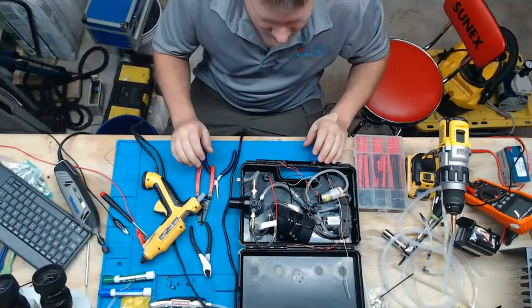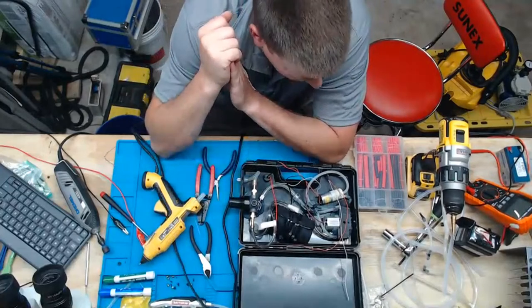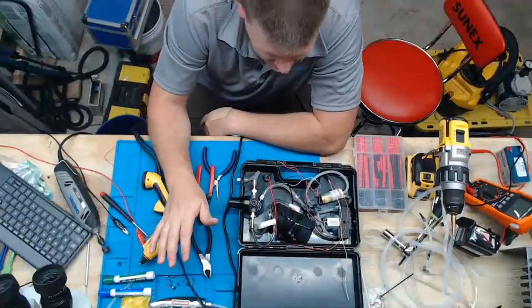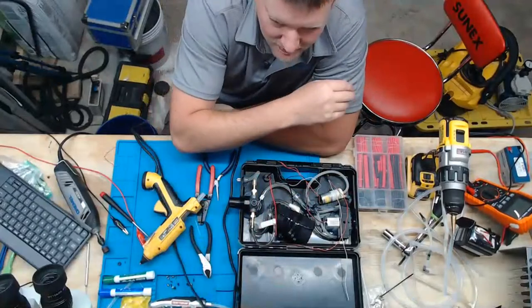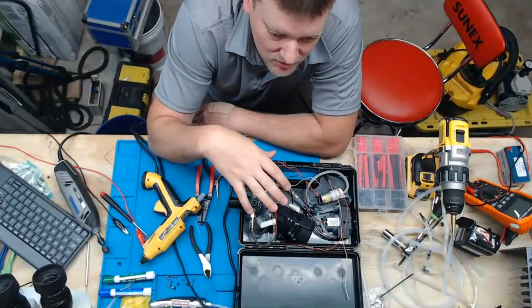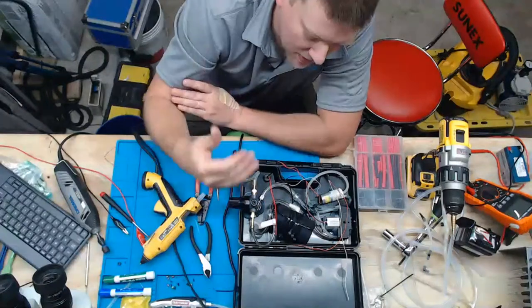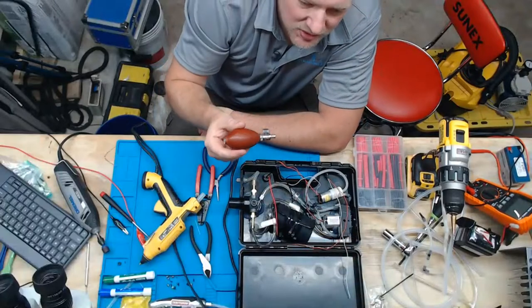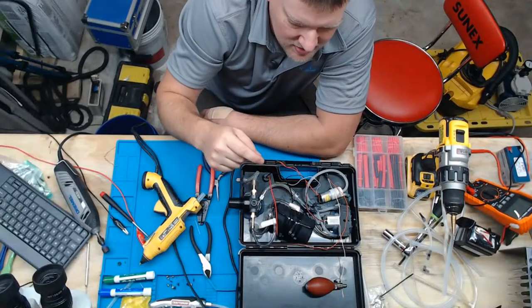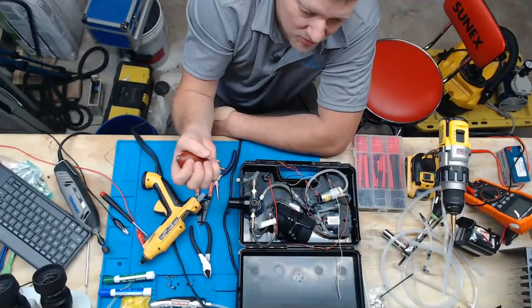I swear my desk isn't normally this cluttered up, but today is an exception because I'm in the middle of making a pressure test jig. And this is a whole composition of different parts, different pieces of medical devices. And what we are going to use this for is testing all sorts of devices that require the biomed to create pressure. And usually we create pressure with things like this. So a squeeze bulb. And the problem is that's not very accurate. And when you get up to higher pressures, with this little squeeze bulb, your arm's going to get really tired.